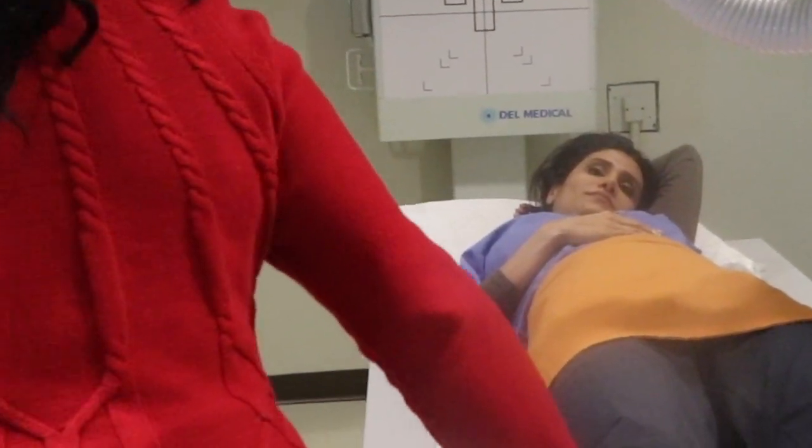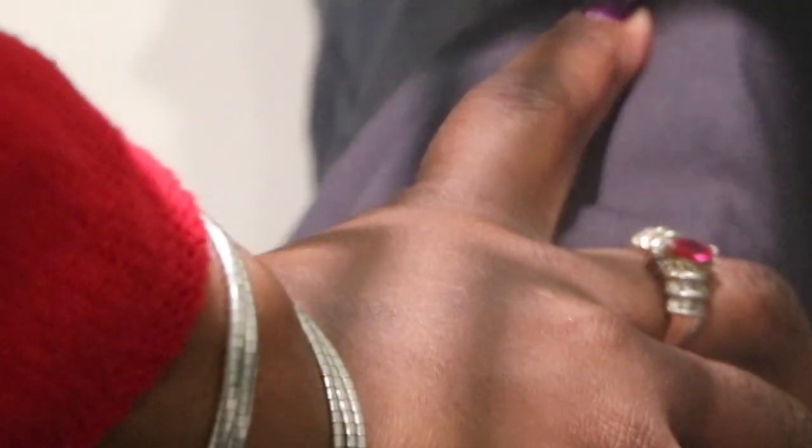So I'm going to center a half inch distal to the apex of the patella. I'm going to bring her down so she's come up tall. I'm going to feel for her patella, which is here.